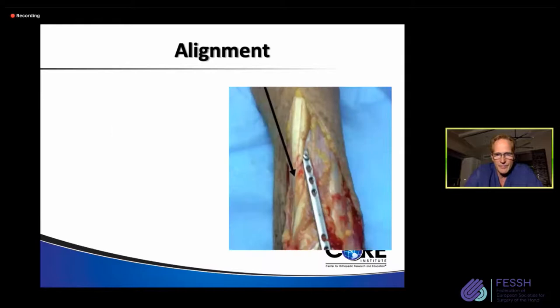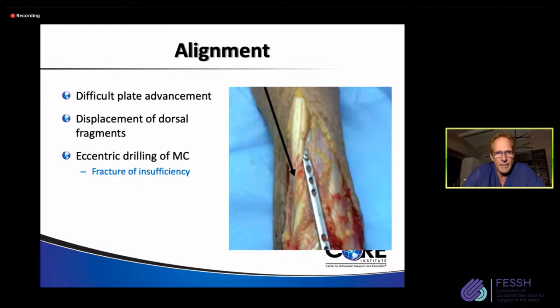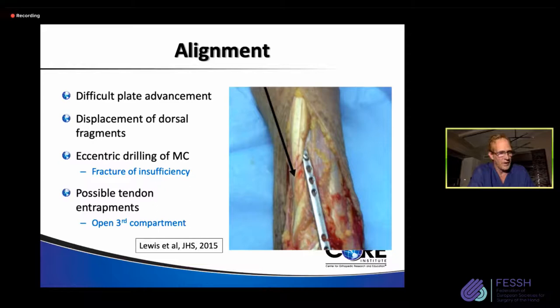This alignment issue also makes the plate difficult to advance as you're having to go around bone and between different compartments, and it's fairly traumatic to pass this sometimes. You can displace the dorsal fragments inadvertently. You could end up with eccentric drilling of the metacarpal, and that could lead to an insufficiency fracture. You also can have possible tendon entrapments by passing over that third compartment.